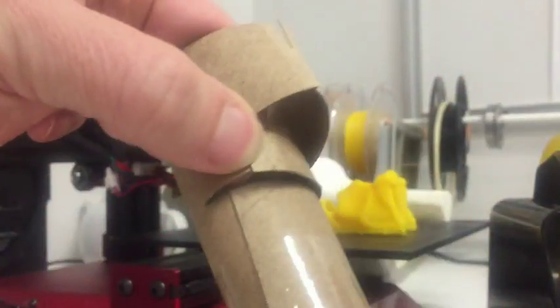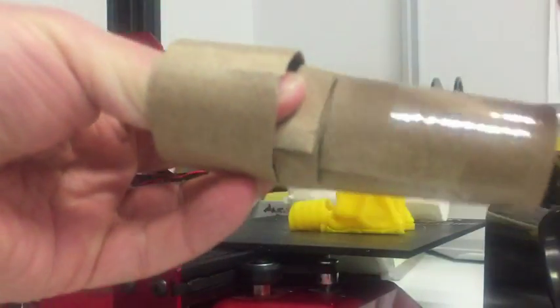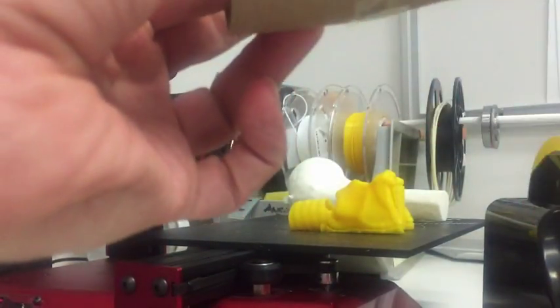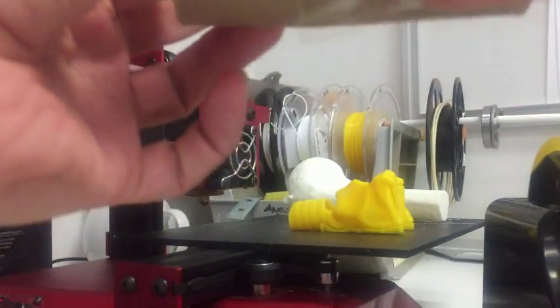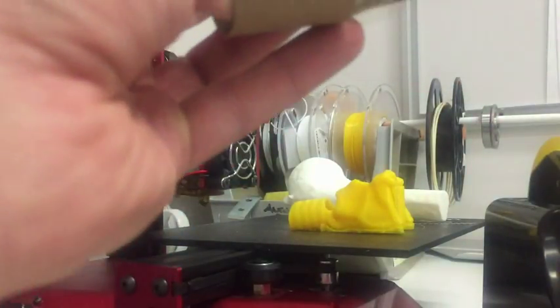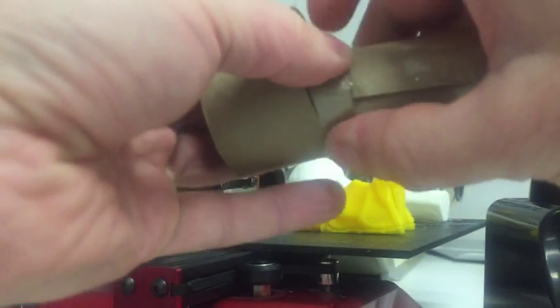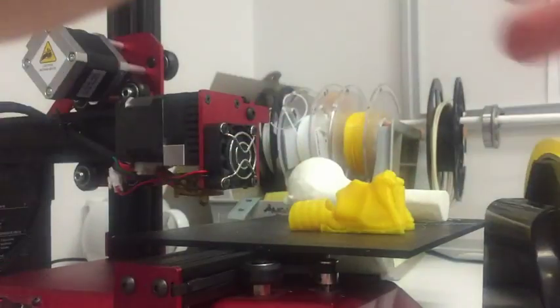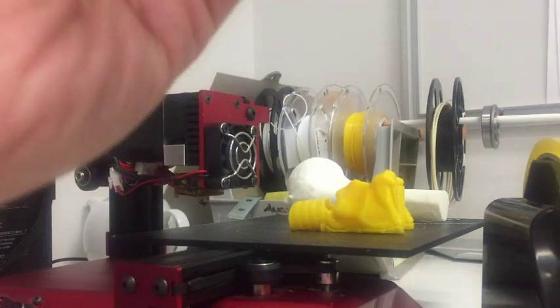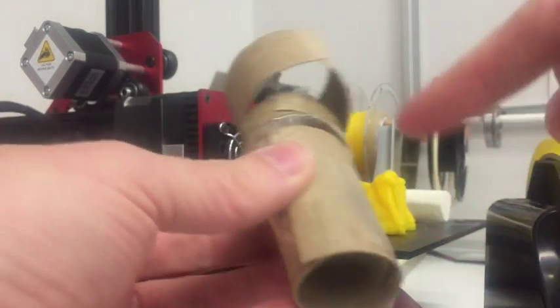This next bit that we're going to fold down and tape in place is ultimately going to turn out to be the cricoid ring. I'm not folding it down quite as much because I want it to be a bit more prominent than the trachea itself, so that it's something that you can palpate when you put it under your bit of gauze or soft dressing to simulate skin. Okay, hopefully this tape will stick. Might put a little bit on the inside as well, if I can reach it. No, I probably can't reach it. Okay, we'll leave that. So now we've got a trachea. We've got a cricoid ring.